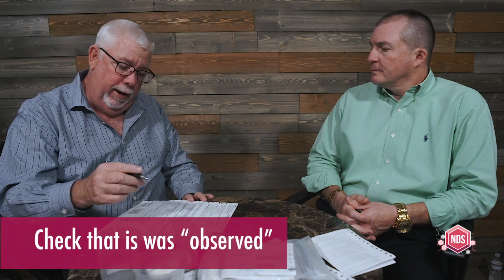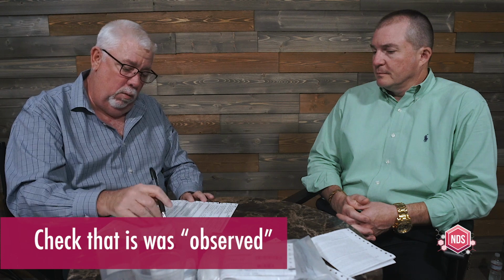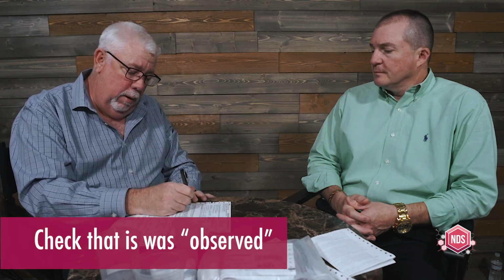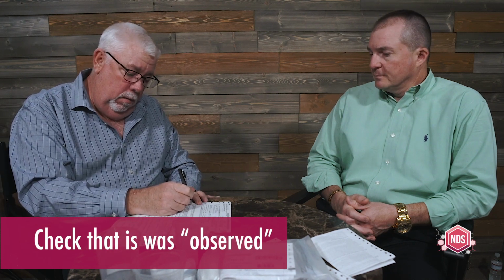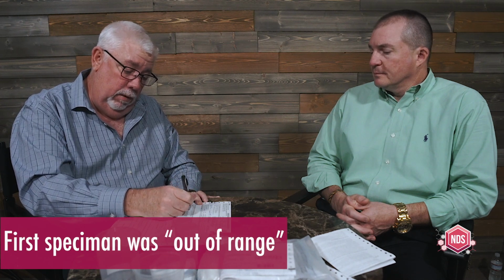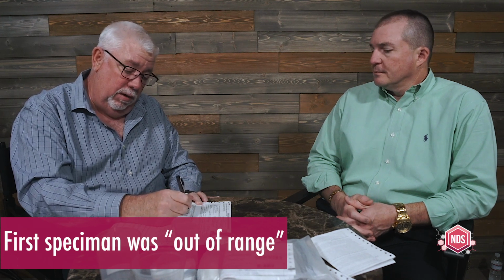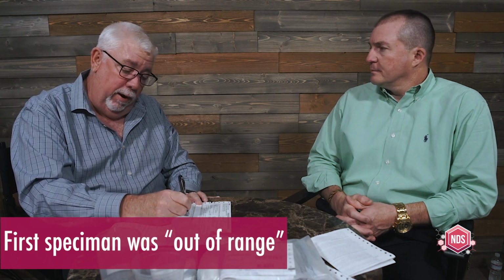Now, very important, on the form, when we do this second collection, we want to check that it was observed. So when we come back and we got the specimen, it was observed. And we're going to put first specimen was out of range. That's the reason why we're doing this observation, because the first specimen was out of range.